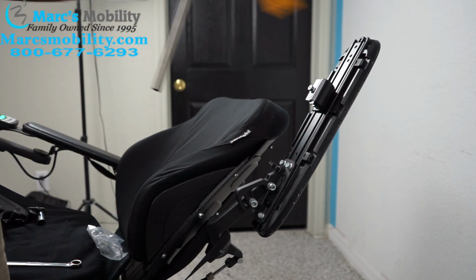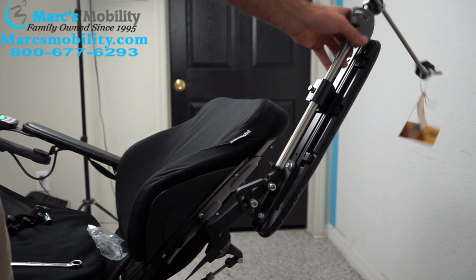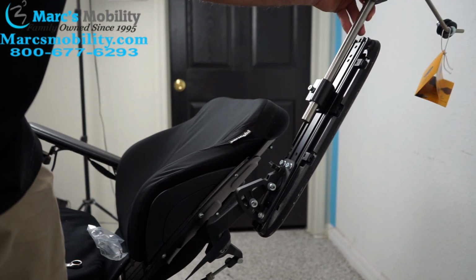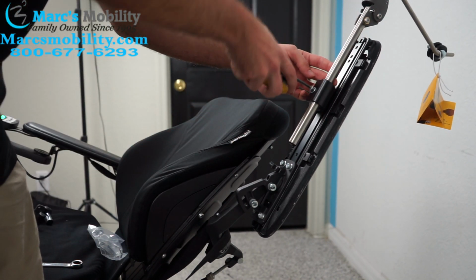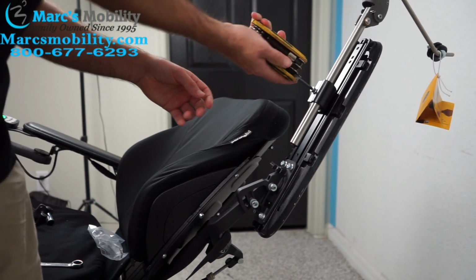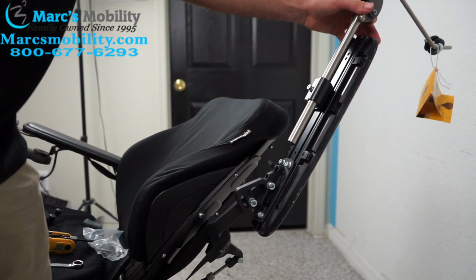Now I'm going to stick in the Omni Control Arm. There it goes, it should just slide in. And then you can tighten it wherever you want it, if you want it further out or further in. I'm going to set it right there. And then we're just going to tighten this screw, same size Allen. There we go, and that is secure.